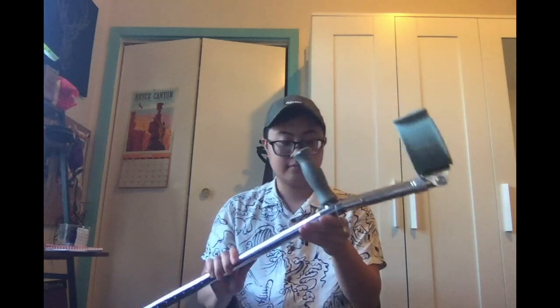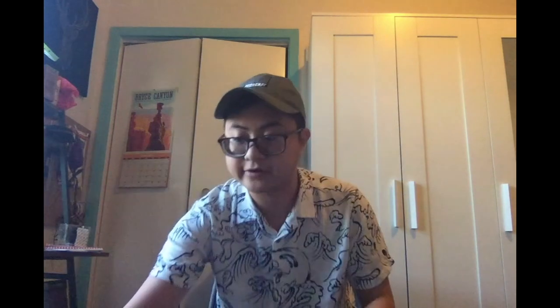So I almost never use these — these are my backup backup pair. That said, they're totally fine for a first pair of crutches.